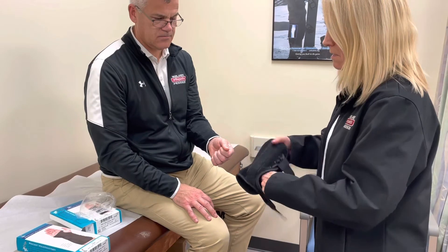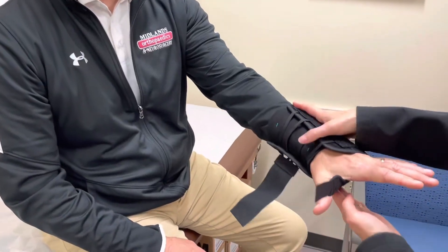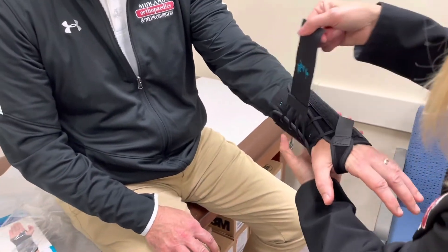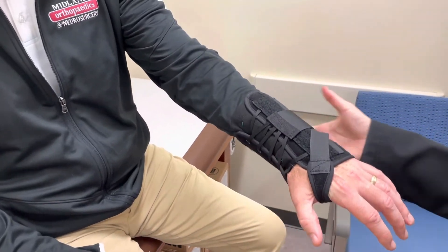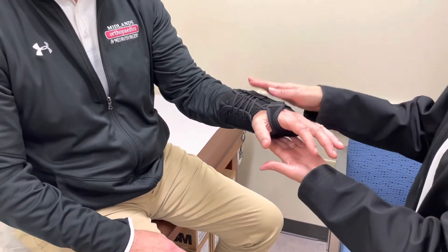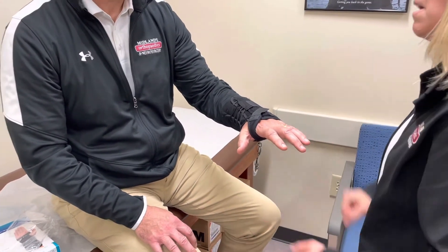So you'll slide your hand in, turn it over — this actually fits right to the palm of the hand — strap it in, and then it's just one pull. We want snug, nothing too tight. This should fit right in the palm of the hand. We'll use this for wrist fractures, wrist sprains, and maybe even some lateral epicondylitis.